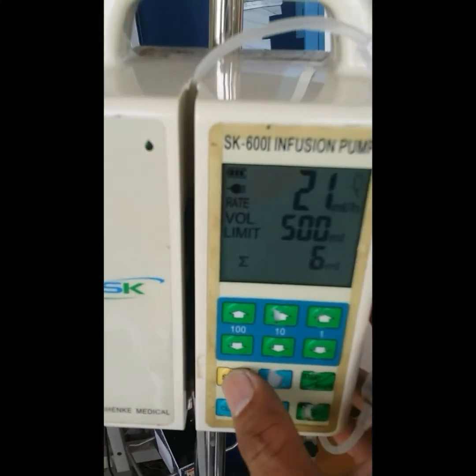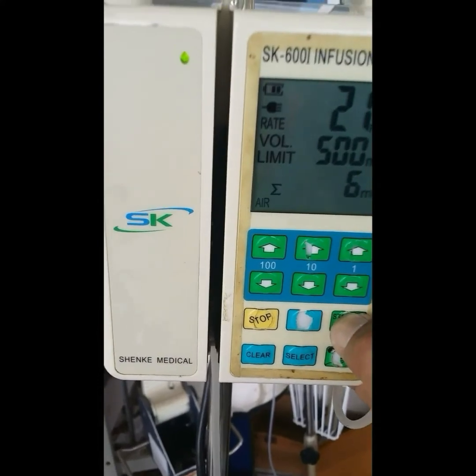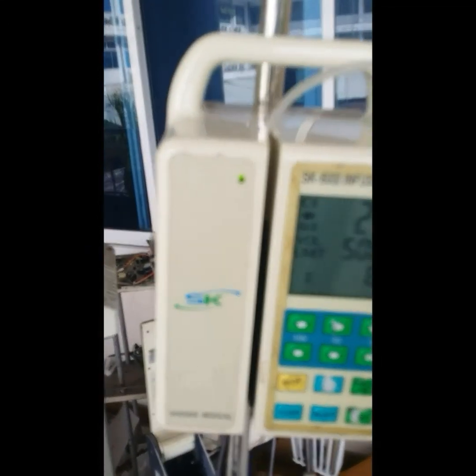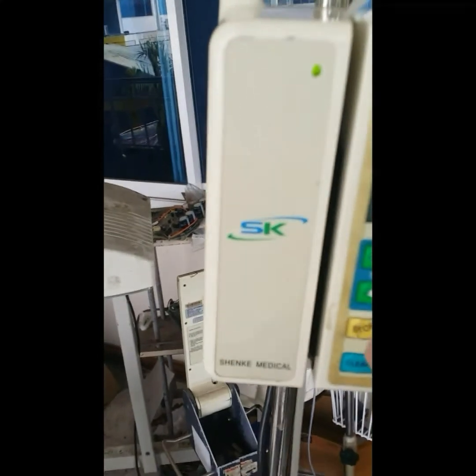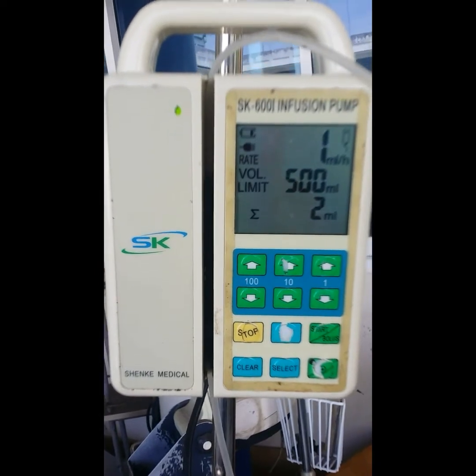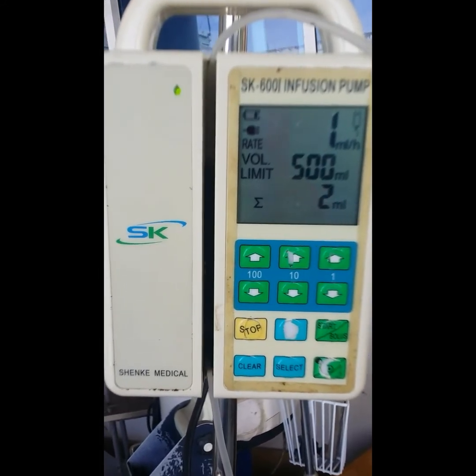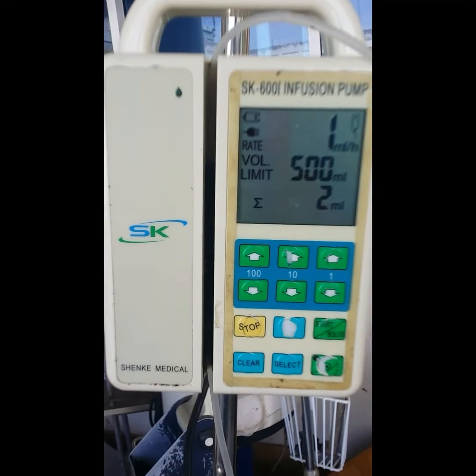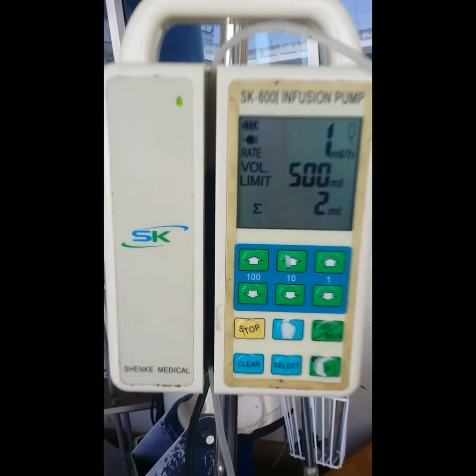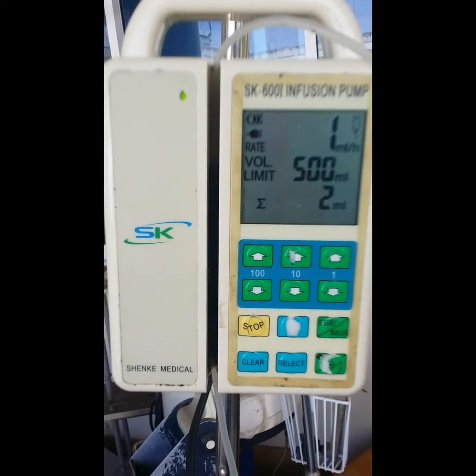I'm going to stop right here and I'm going to make a bolus. The infusion pump is now functional. The next thing to do is to calibrate it and test it for 24 hours or more, then redo calibrations again. Once it passes, it's now ready to use. We're going to put a label that it is calibrated and ready for use.